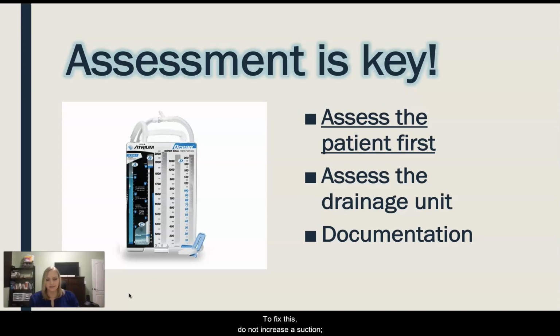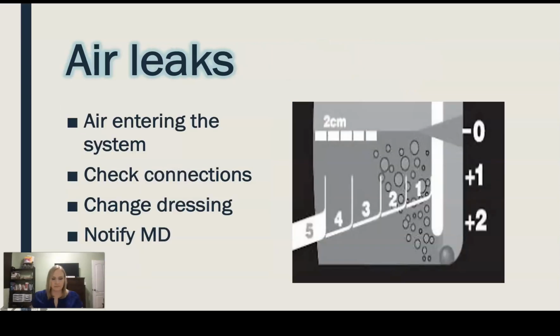To fix this, do not increase the suction. Instead, fill the water to the designated water level. Ensure that all connections are tightened and/or reinforced.